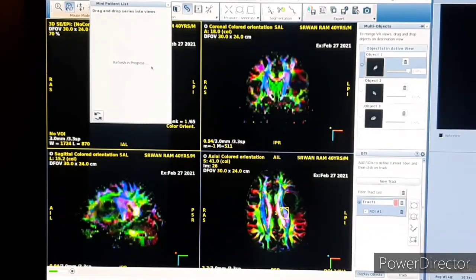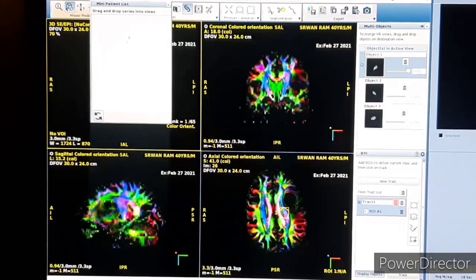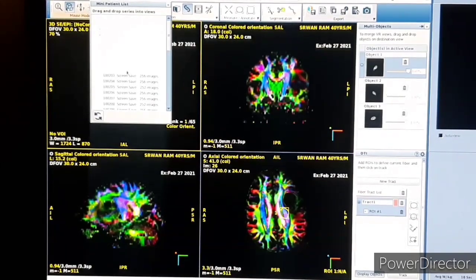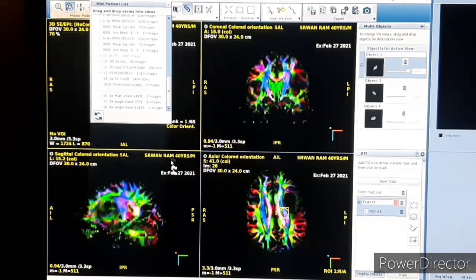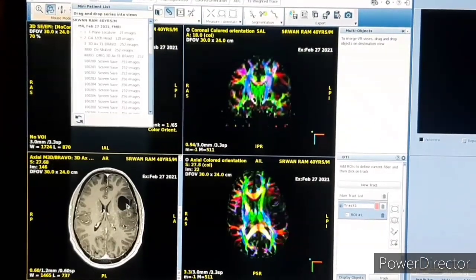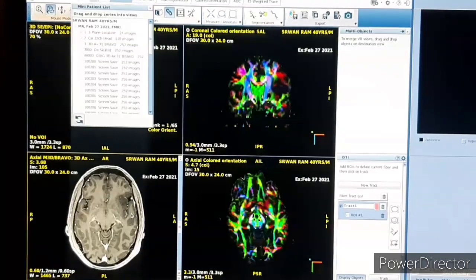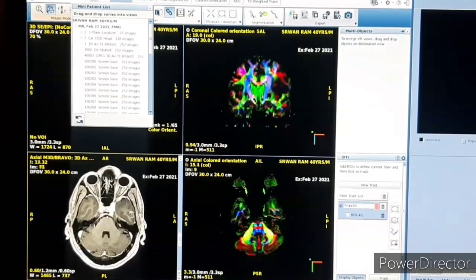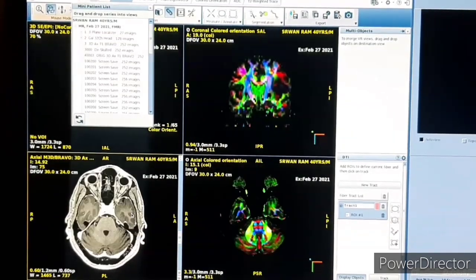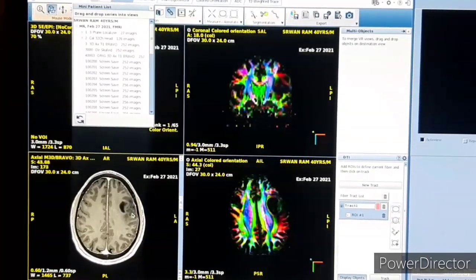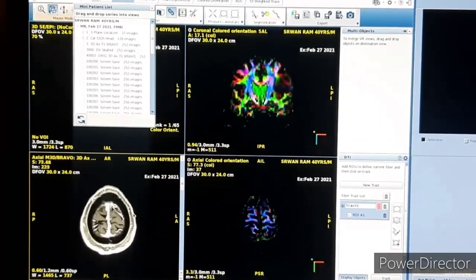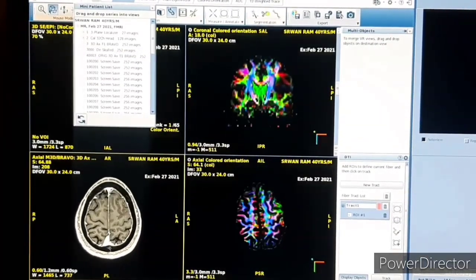First we will load the post-contrast BRAVO or T1 sequence. We just drag it into one box, and you can see where the tumor is. You can see the tumor in the image.